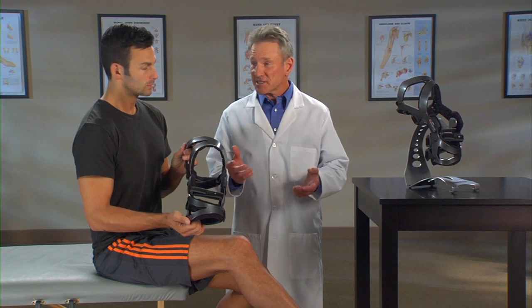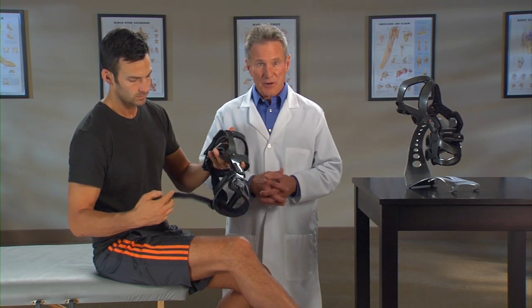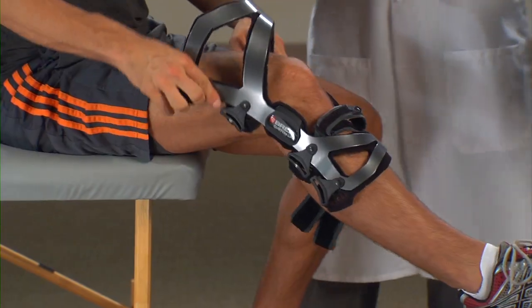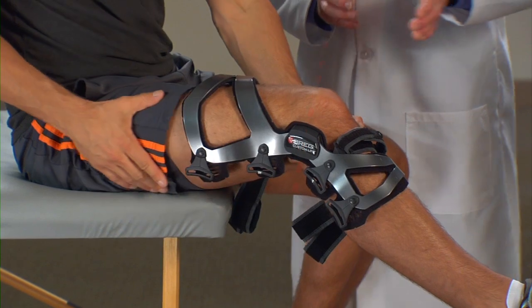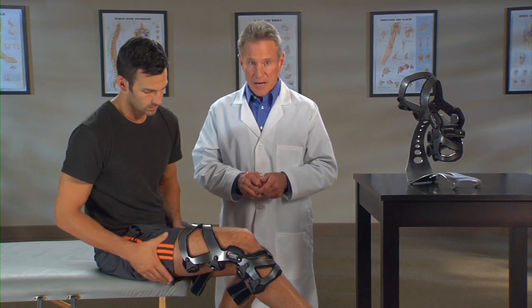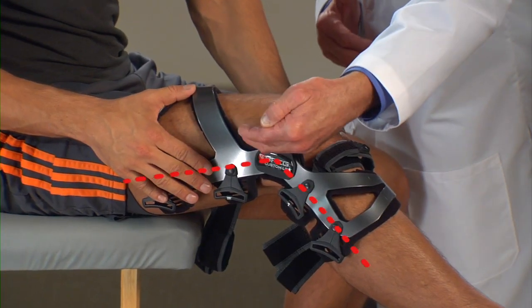The LPR knee brace is easy to put on. Start by unfastening all the straps except for strap number three, which can just be loosened. Folding the hook loop tabs back against the straps will stop the straps from getting tangled. Sit with your knee bent at a 30-degree angle in a gas pedal position. With the brace fully extended, slide it down onto your leg. Position the brace so the center of the hinges align with the top of your kneecap. The hinges may be positioned behind your bent knee — this is normal. You'll see that as you fasten each strap, the hinges will move forward until the brace is properly positioned on the leg, slightly behind the midline of your knee.